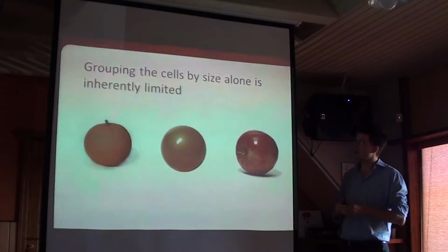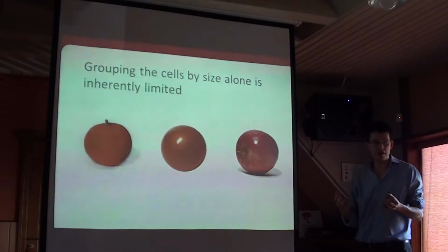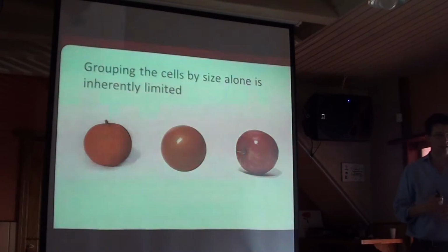The impedance analyzers work sorting by size alone, and theoretically all those things would be exactly the same.